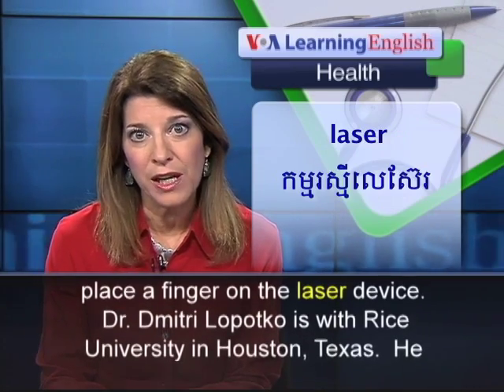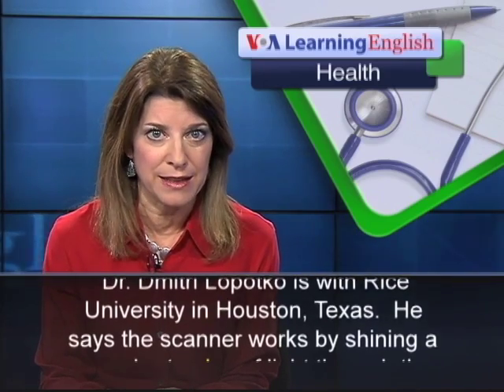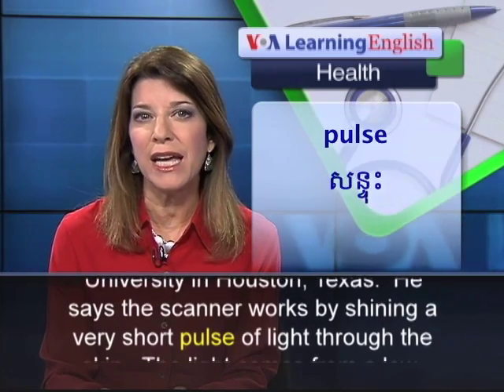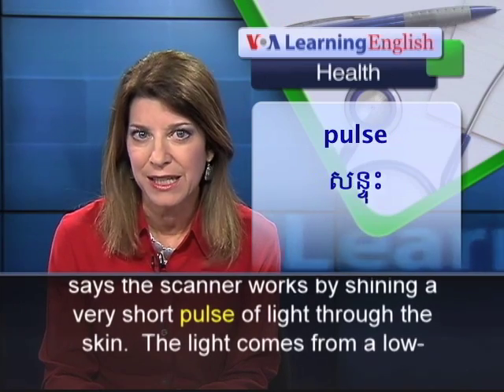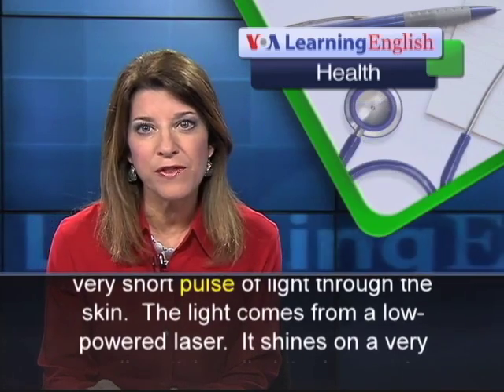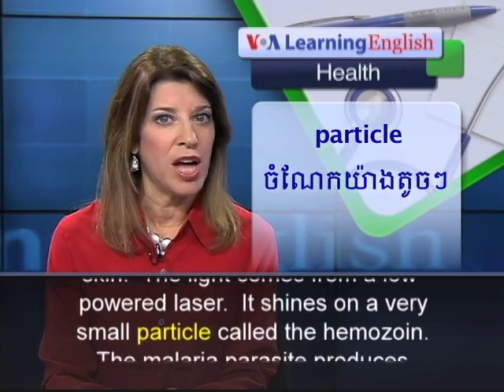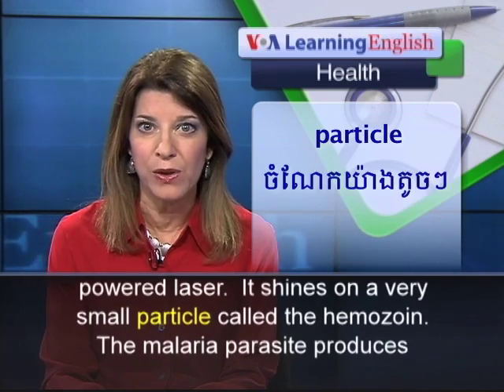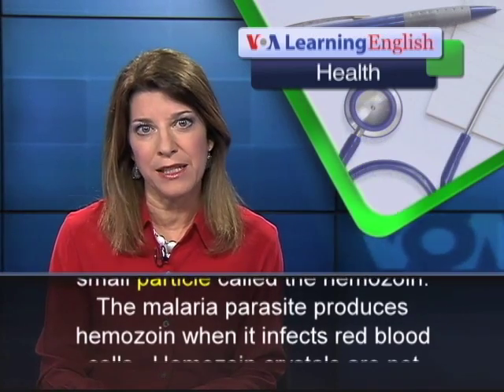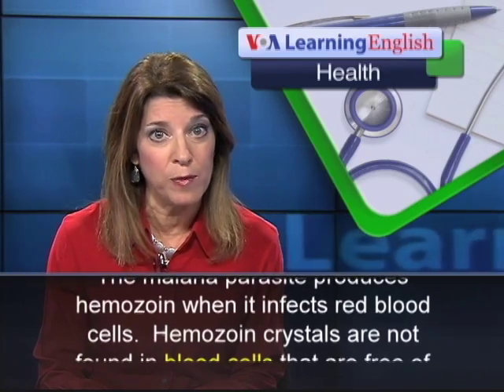Dr. Dmitri Lopotko is with Rice University in Houston, Texas. He says the scanner works by shining a very short pulse of light through the skin. The light comes from a low-powered laser. It shines on a very small particle called the hemozoin. The malaria parasite produces hemozoin when it infects red blood cells.